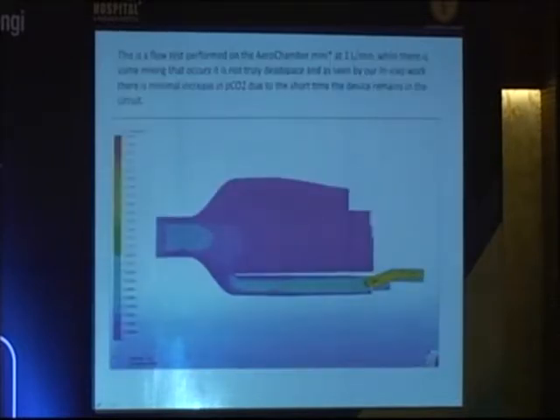If this is the system right here, this is the spacer, and this is exhalation. Say the patient is hooked up to this end right here. When they exhale, rather than exhaling those very small particles that didn't deposit into the lung back into the chamber to be re-inspired, the gas flow will take it down into a little passageway so that it can be exhaled out and back into the ventilator circuit. So it's a very unique system, and we never really tested it. And then finally we came up with some funding.